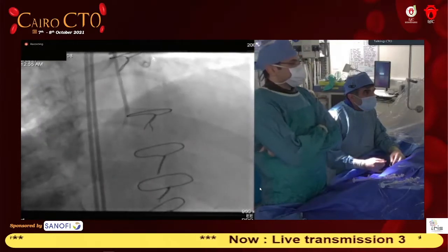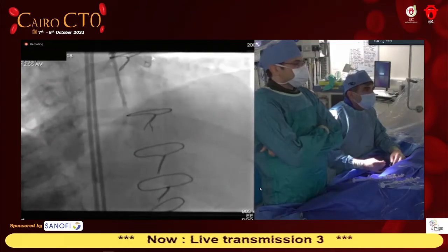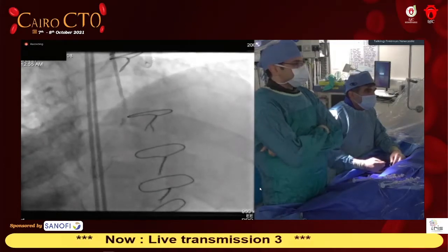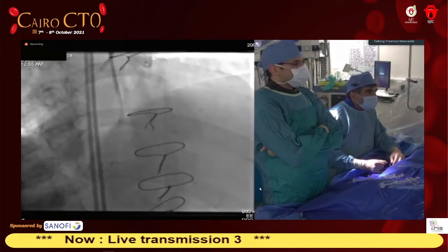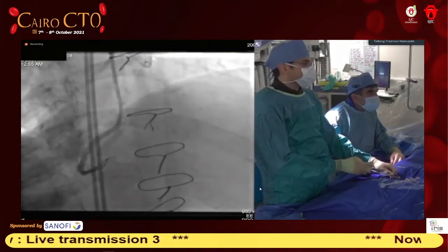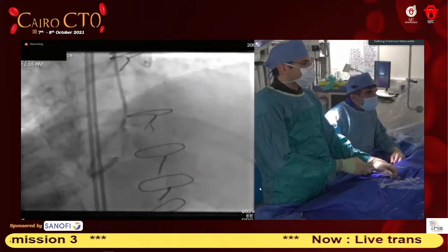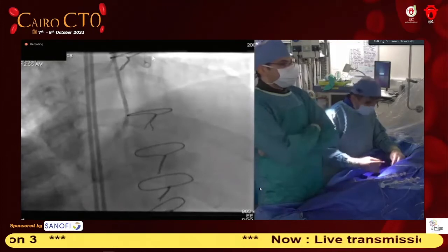Sometimes you decide to stop when it's good to stop, you know. Yes, absolutely. That's absolutely correct. I think this is becoming the subintimal space here. Yeah, I need a cyan black wire, please. That's enough. Cyan black. Yeah.